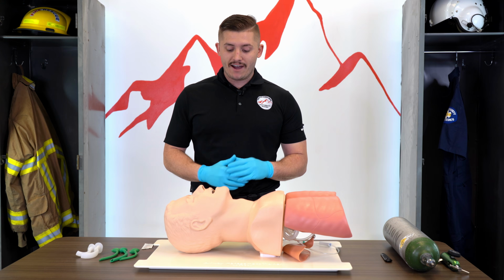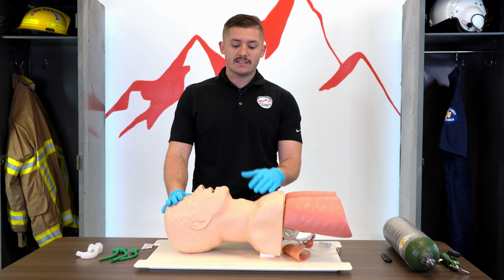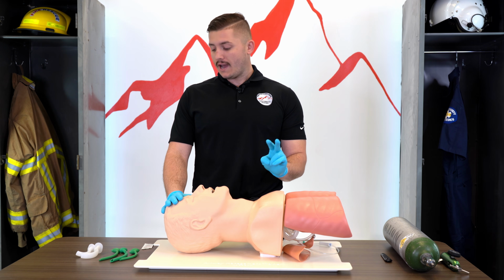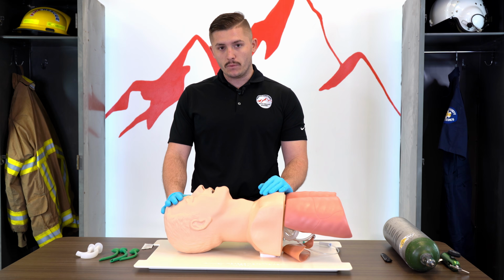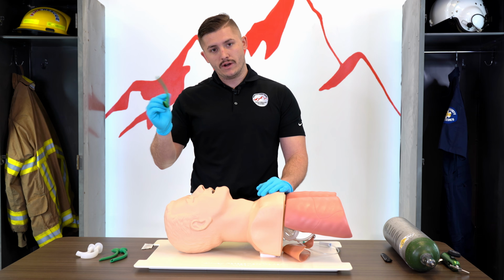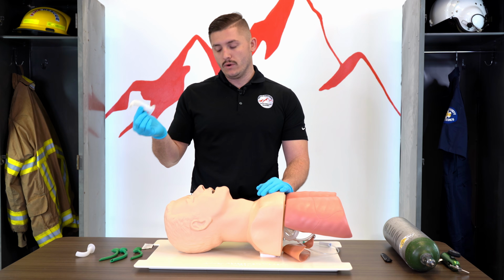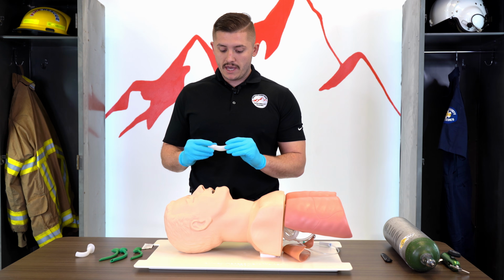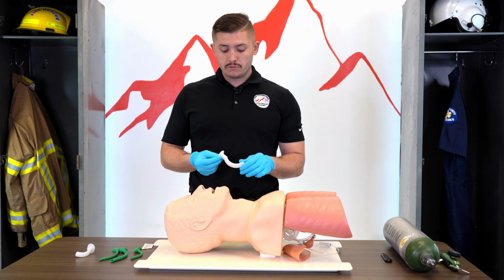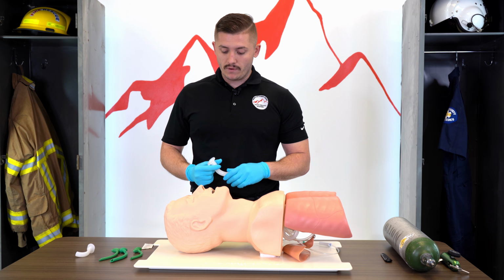Okay guys, now that we have our airway completely clear, we can now place an adjunct to assist in ventilating our patient. So as EMT basics, we have two types of airway adjuncts that we could use. We have an NPA, or a nasopharyngeal airway or adjunct. We also have an OPA, an oropharyngeal airway or adjunct. OPA is pretty much used for the most part on most patients because they're simple to place, and if our patient has a gag reflex, we can take it right out.